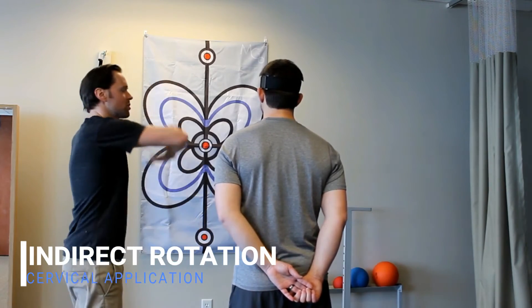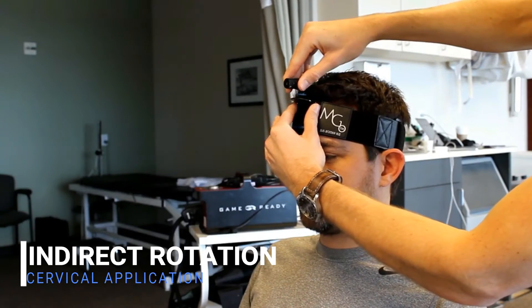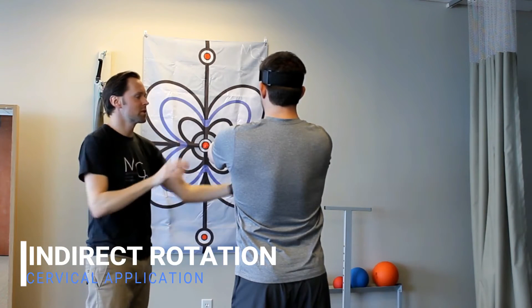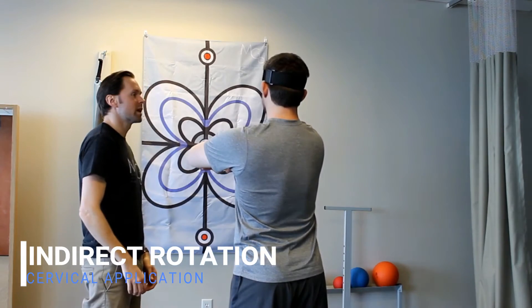So Chris, let me have you just cross your arms holding like this. We're going to turn that laser on, and what I want you to do is keep the laser in target there and slowly rotate your chest towards me and go as far as you can.